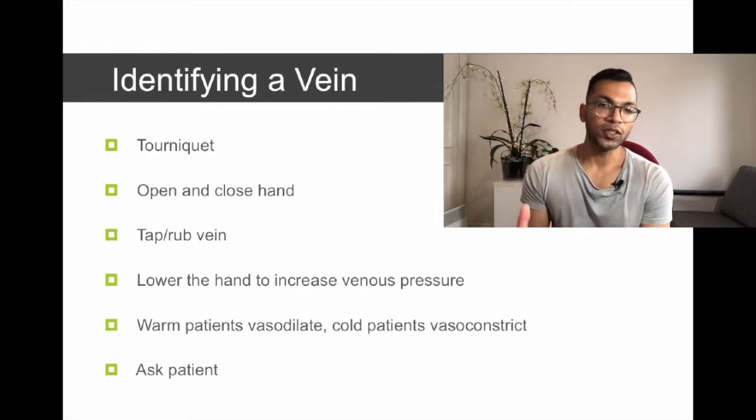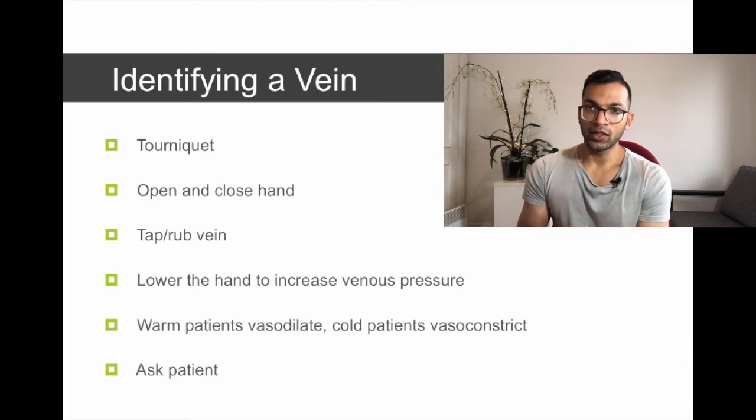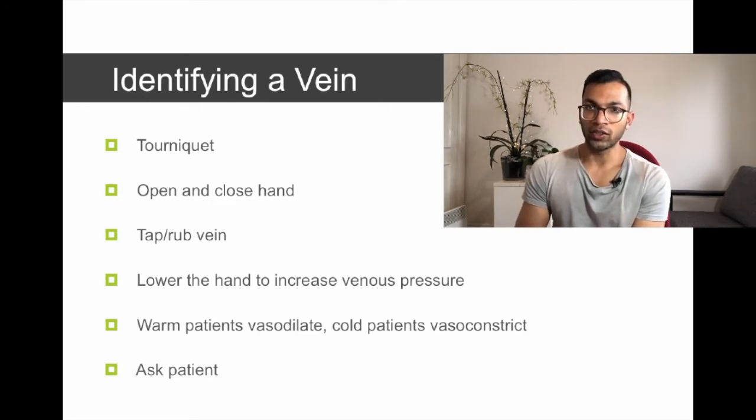One thing that's not really talked about is that after you access a vein, if a cannula is taken out, that can cause a bit of a problem if you don't apply pressure. It will cause bleeding into the subcutaneous tissue. So patients with very limited venous access, I always encourage them and tell them whenever someone has accessed their vein or removed a cannula to put pressure on that area for a significant amount of time so they don't lose that vein due to repeated trauma.